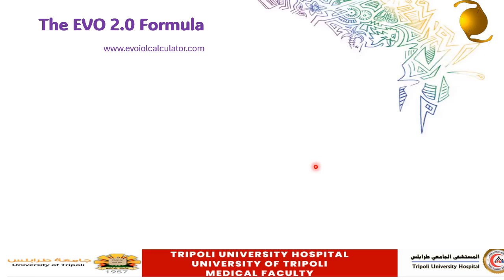But similarly, after different studies done, especially by Dr. Miller, it shows that this formula has a defect and shortage in the extremes of eyes, and this means the principle of emmetropization may break down in the extremes, when there are long eyes or short eyes. However, with average sized eyes, as we said before, it shows good reproducible results.